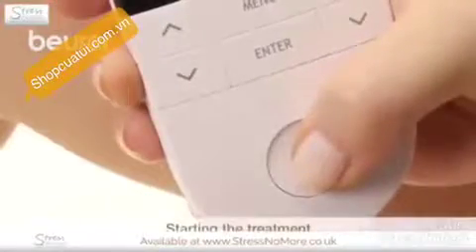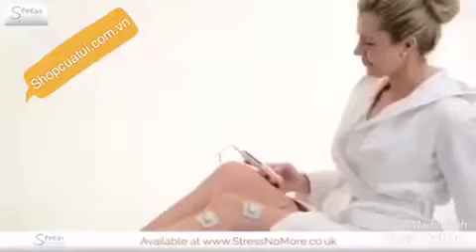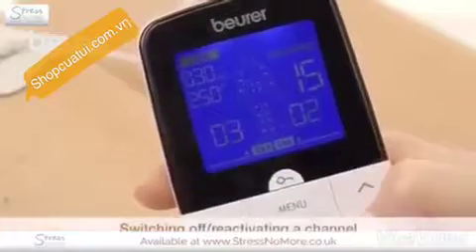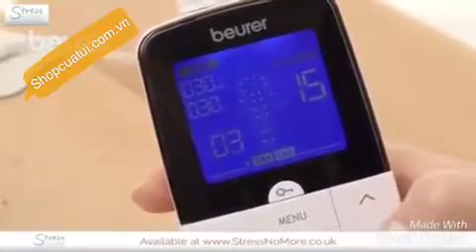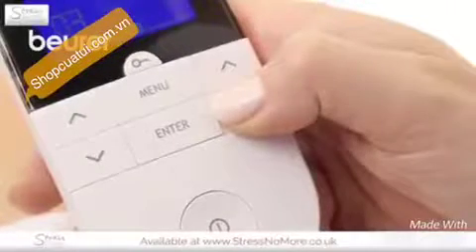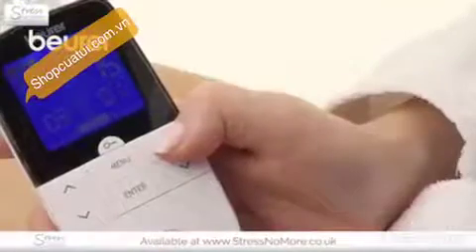Start the treatment with the ON-OFF button. You can also interrupt the treatment with ON-OFF. Press the down-arrow button to the lowest level to switch off a channel, then press and hold the button. Press and hold the up-arrow button to reactivate.